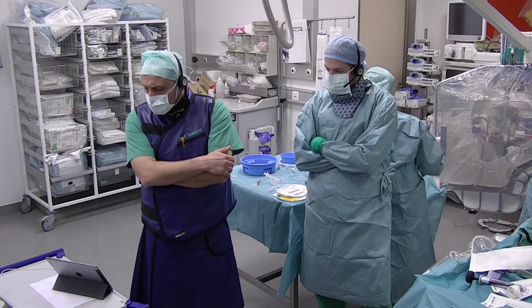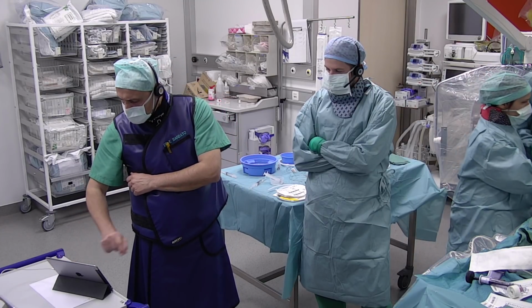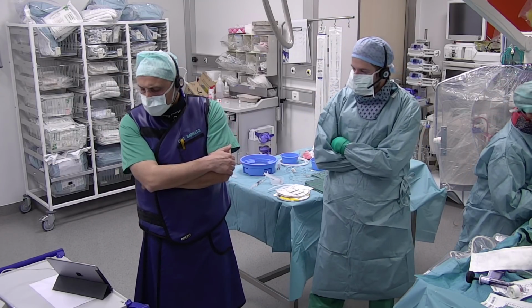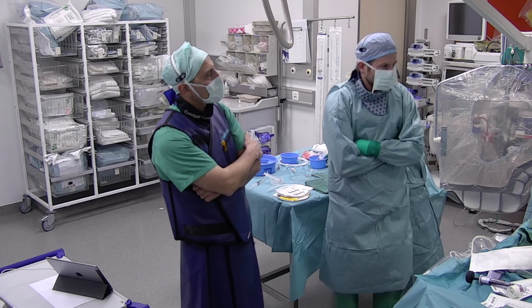This is an interesting question here. What is the best technique to place left main at optimal position covering the ostium with not much protrusion? Would a third wire in the aorta help? Have you tried this technique? Exactly. This is something we also plan to mention.